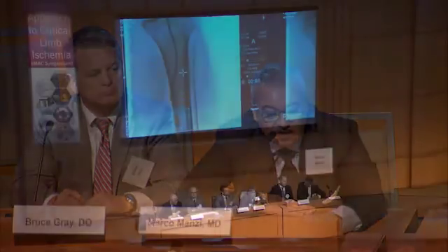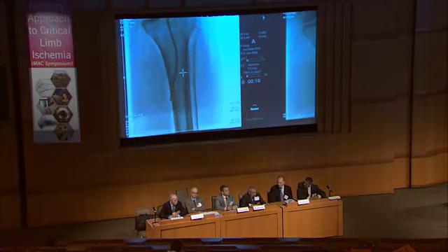It would be really interesting to have an imaging-guided decision about angiosome and about the wound-related artery, to see if there is really an improvement in blushing around the wound area after this recanalization, because it's crucial to know if what we are doing now is useful for the patient.